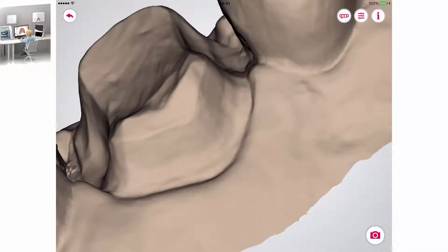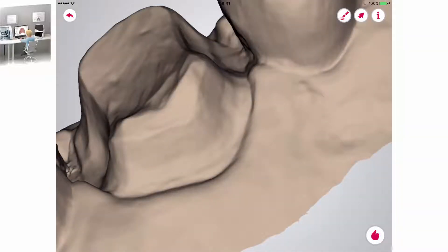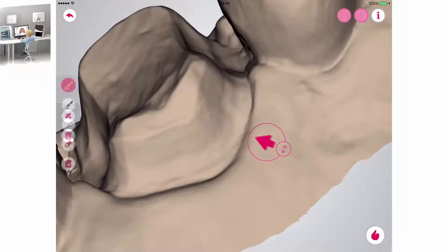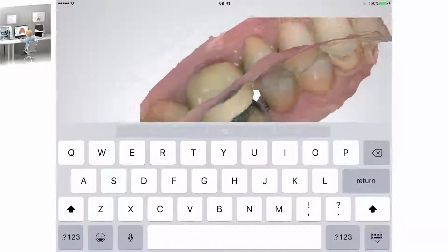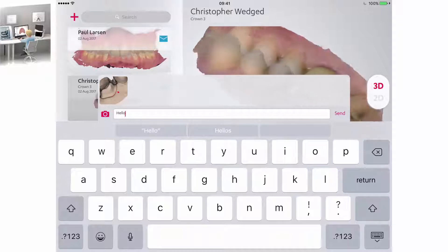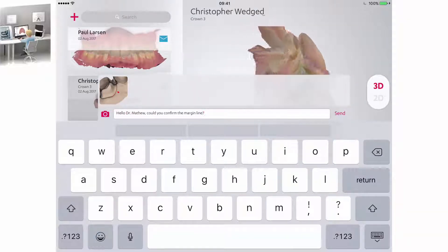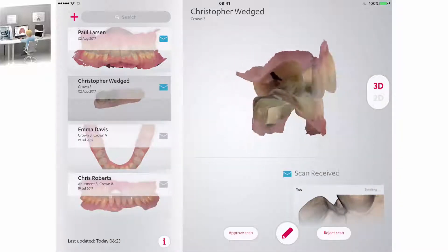In order to take a photo, touch the camera icon in the bottom right corner. A screenshot will be taken and two new buttons appear in the upper part of the screen. They enable you to put arrows in the picture or draw with your fingers over it. When you finish creating a picture, touch the thumbs up button and you will be moved back to the previous window. Using the keyboard you may write any additional commentary that will be included with the picture. Touch send to have that message sent to the dentist.